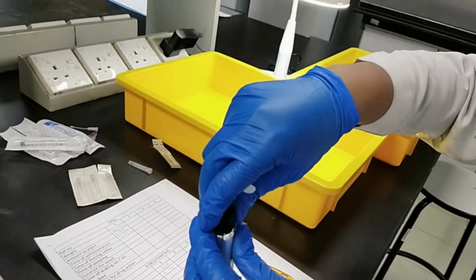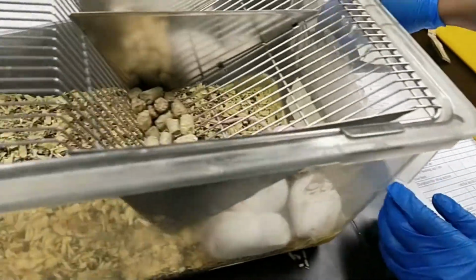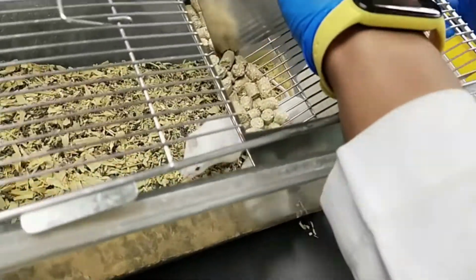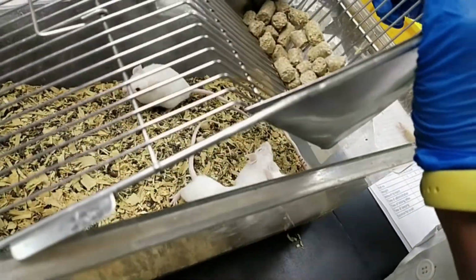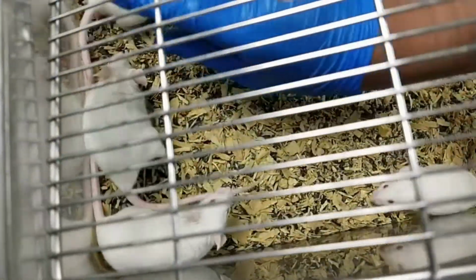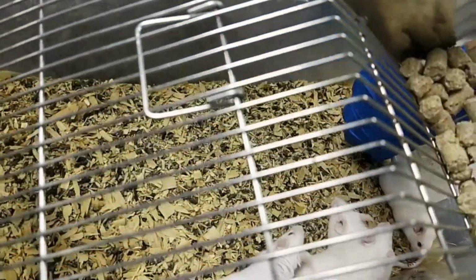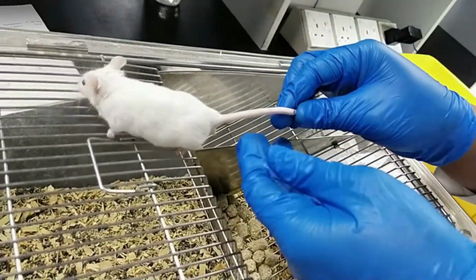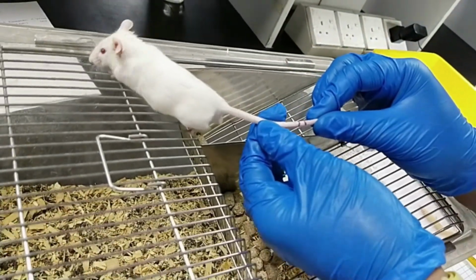So for this one we're going to use the mice number 2. So we're going to take the mice from this cage. So we need to find out which one is the mice number 2. This one, mice number 2. So we need to look at the tail, labeled as mice number 2.